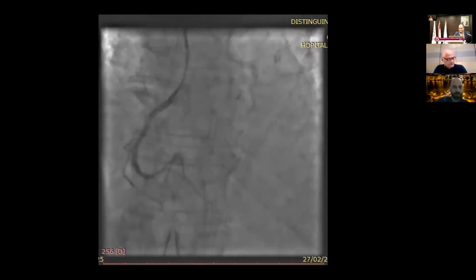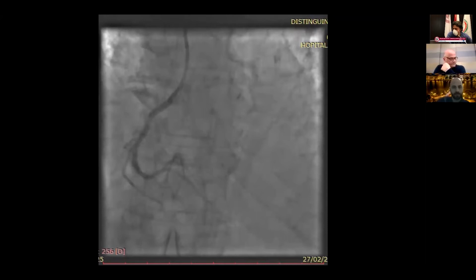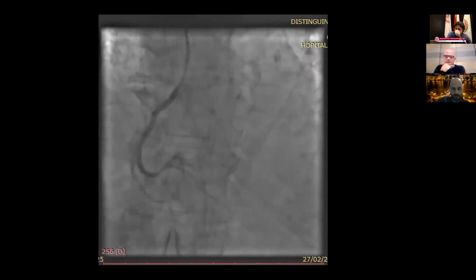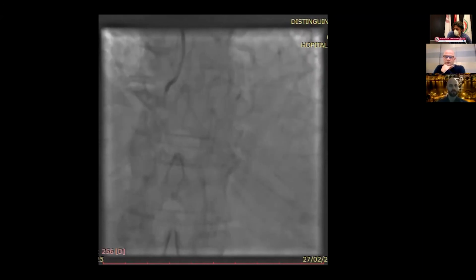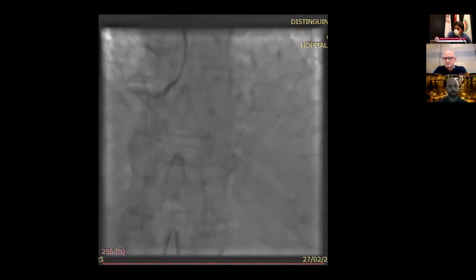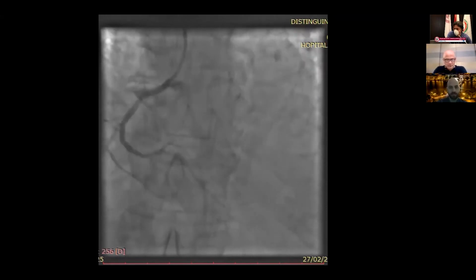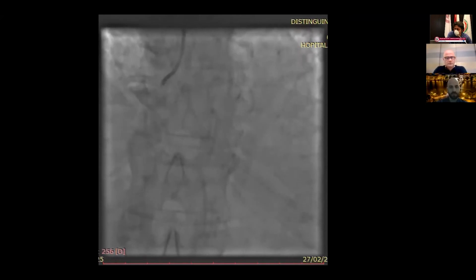Thank you. Dr. Edis, from the attendees, there is a question, and I raised it before. What is the place of shockwave balloon? Like I said, in this calcified lesion, the balloon has passed the lesion, but it's not very well dilated. I think the shockwave balloon can pass this lesion. Oh. Is any... No way.